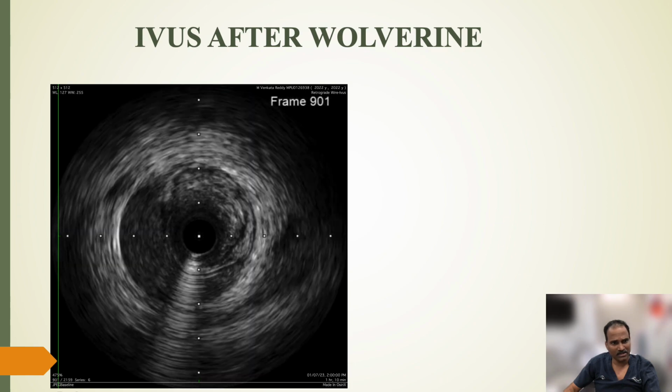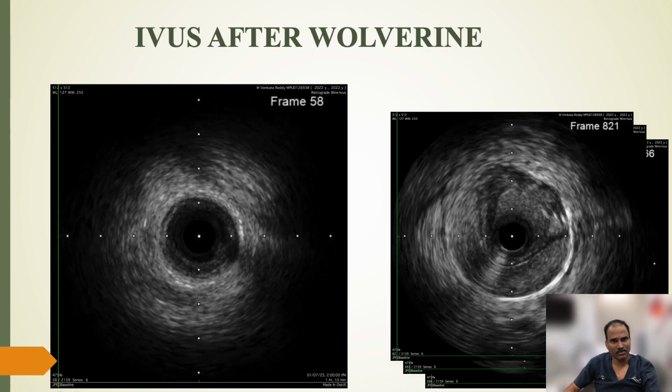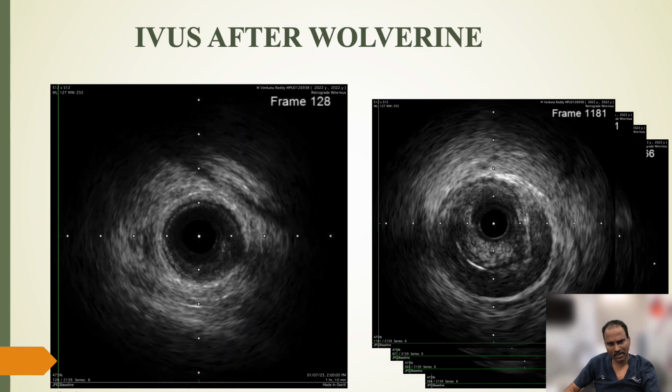So since there was no fenestration, we decided to go ahead. You can see here.